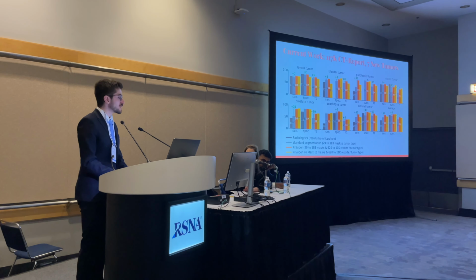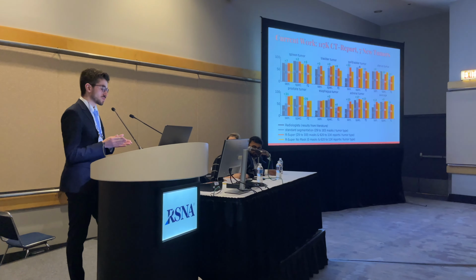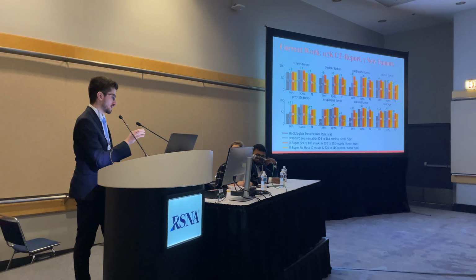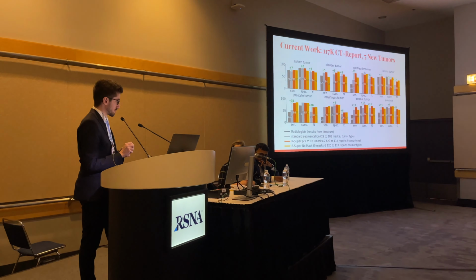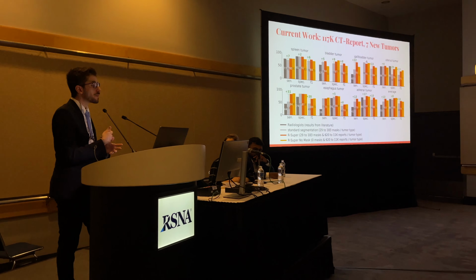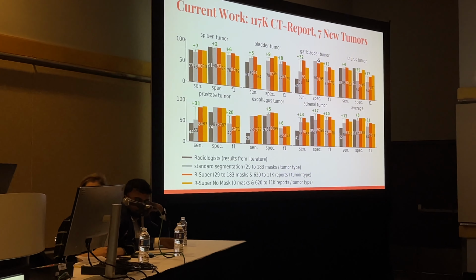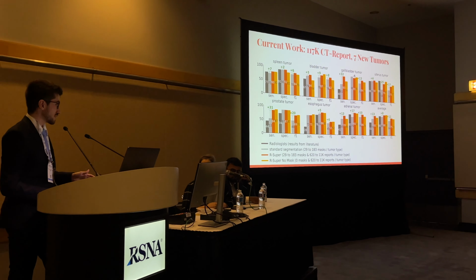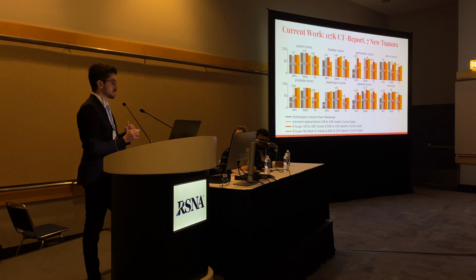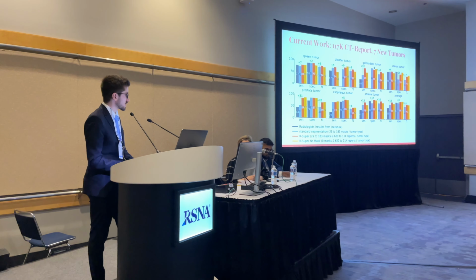Yes, so for many of these cancers, CT is not the main modality to find them. But we see that AI sometimes can see things that humans cannot. So especially for prostate, you see here that the AI performance is much higher than the human performance. So we think this shows that AI can become a technology to make CT an additional opportunistic tool to detect these cancers. We have access to a very large data set, about 500,000 reports, and then we use an LLM to search across these data sets and find these cases where, for example, for prostate tumors, the doctor wrote about the tumor size in the reports for the CT scan.